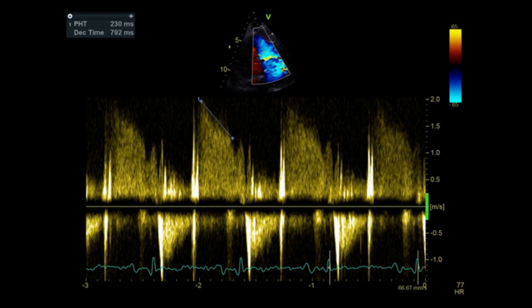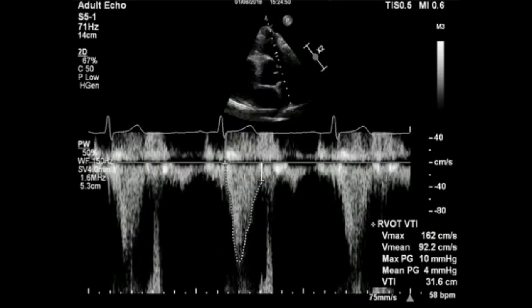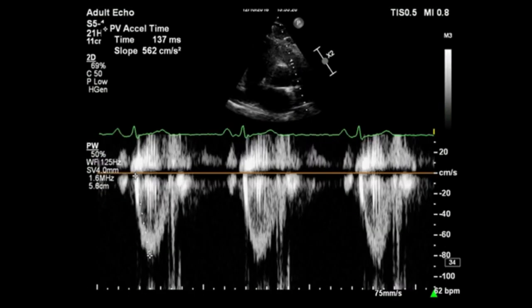You could also measure the pulmonary regurgitation pressure half-time (PHT). Now let's move to the next structure. After you have finished the visual assessment of the right ventricular outflow tract, you can measure the RVOT 1 diameter and the RVOT 2 diameter. Now use pulse wave Doppler at the right ventricular outflow tract, and if needed, you can also measure and obtain the pulmonary velocity acceleration time.